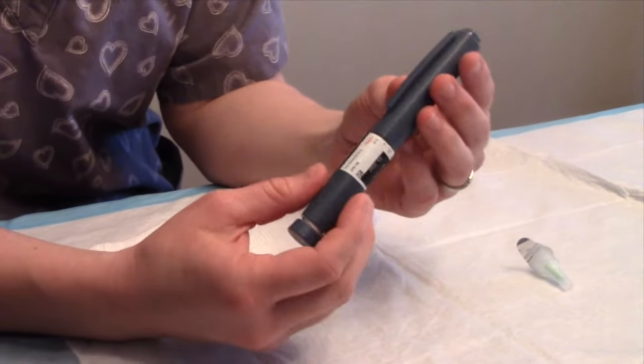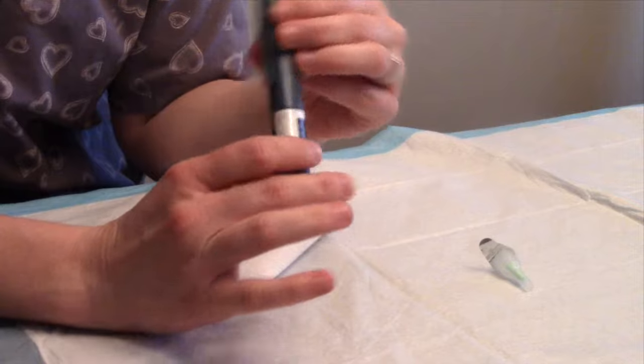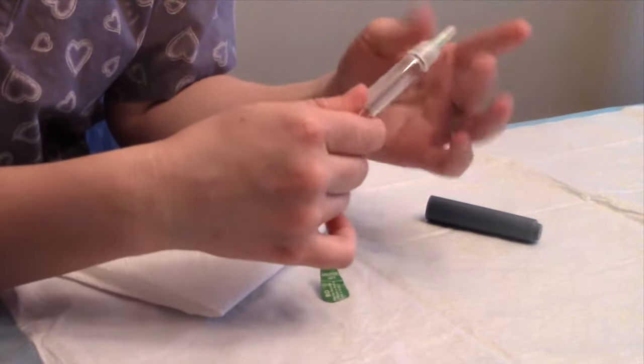We're going to talk about administering insulin with an insulin pen. This is the pen right here, and what you're going to want to do is remove the cap and put the needle on. Just twist right on.